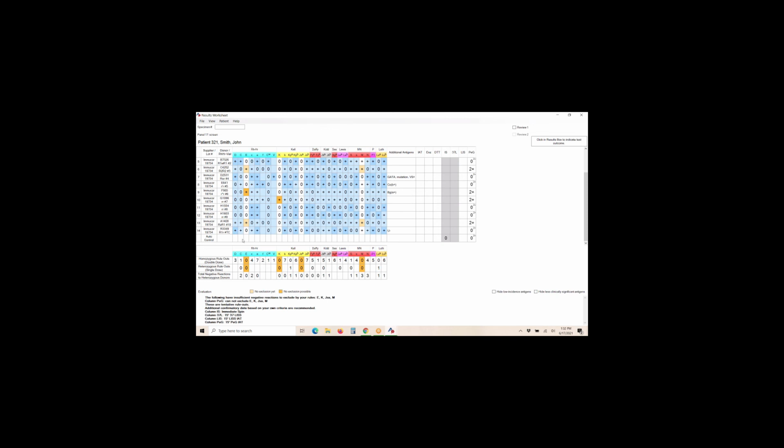Okay. Now for big C, we'll have 1 here, and then we have a single dose here from a heterozygous donor. You can see the rule says it fails to rule out C, but it's because we want to have a double dose cell. Now, if all the cells had a reaction with all the D positives, so basically there was an anti-D there, then you can rule out big C in the presence of D. But this cell did not rule out, and it tells you that it doesn't rule out, and the reason why. And you have the similar situation down here as well with this cell.